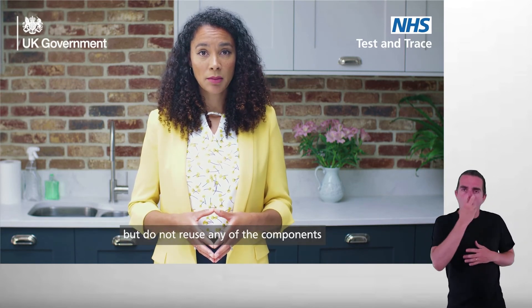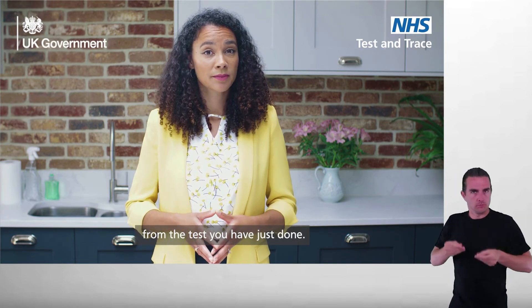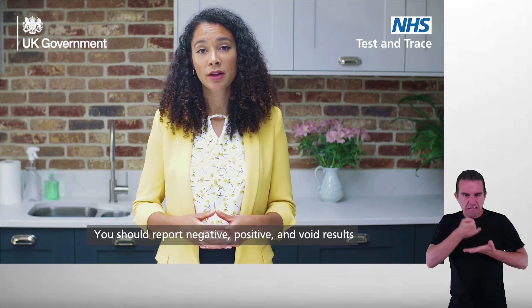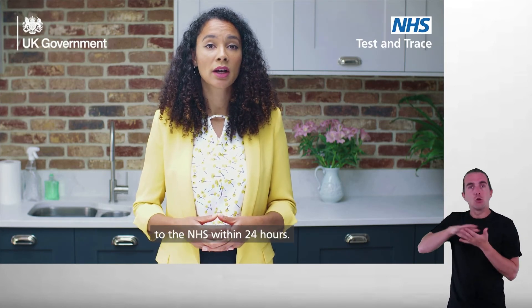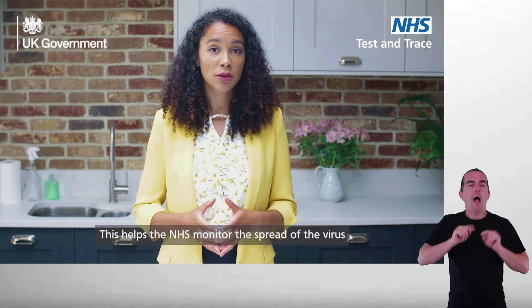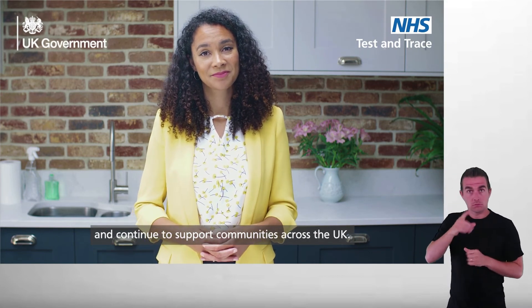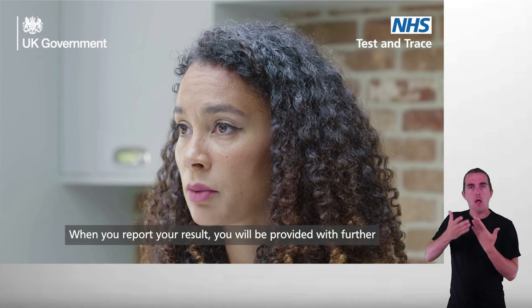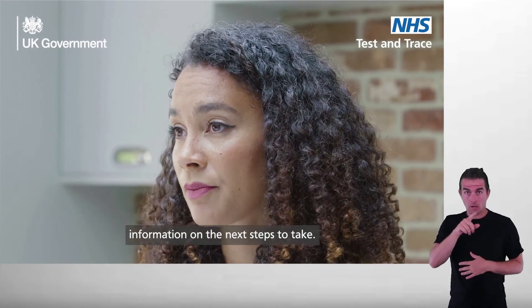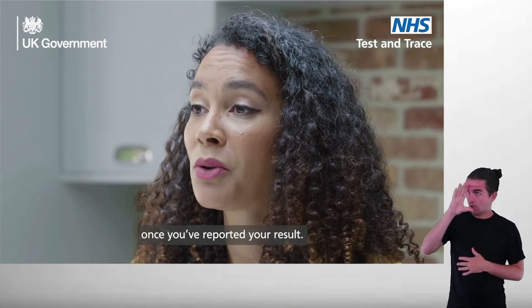Use a new test kit but do not reuse any of the components from the test you have just done. You should report negative, positive, and void results to the NHS within 24 hours. This helps the NHS monitor the spread of the virus and continue to support communities across the UK. When you report your result, you will be provided with further information on the next steps to take. Remember, you've only completed your test once you've reported your results.